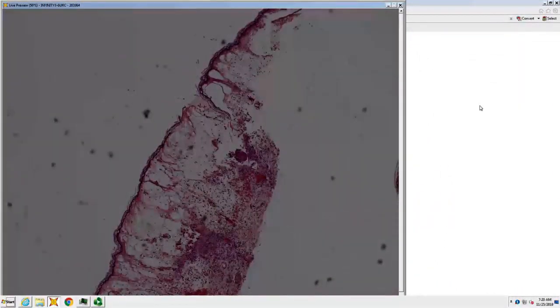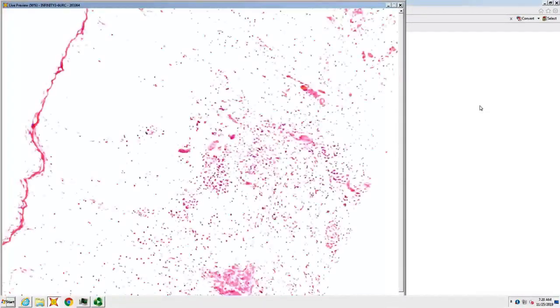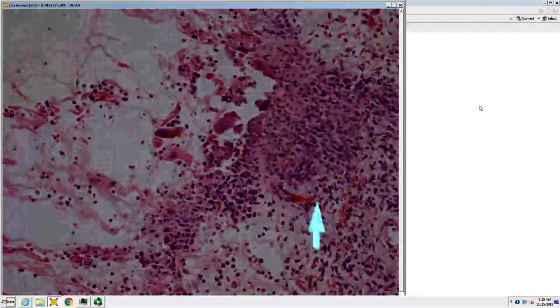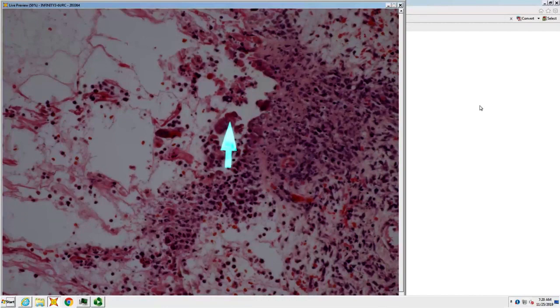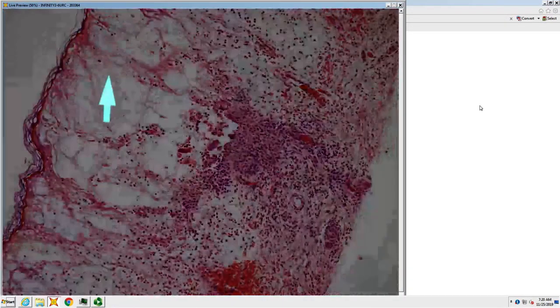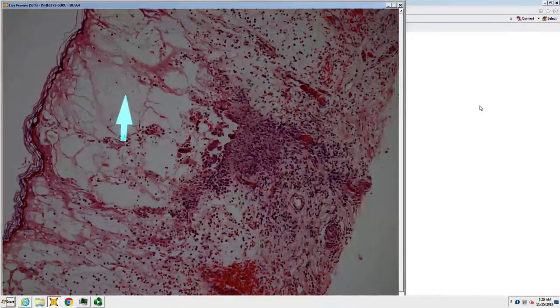There's nice broad reticular degeneration, so I'm thinking viral. So thinking viral, and is there only reticular or also ballooning? There's also ballooning, which could be a pox virus, but that looks like margination molding, so herpes virus. Yeah, exactly. So the little bit of a red herring to start, because reticular degeneration, you normally think of pox or enterovirus.